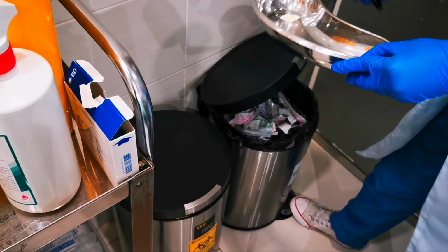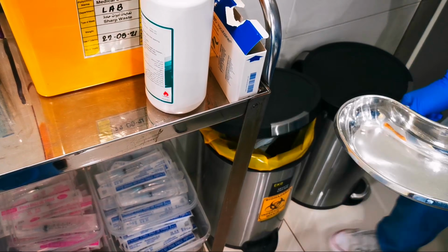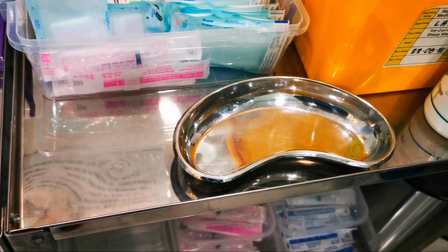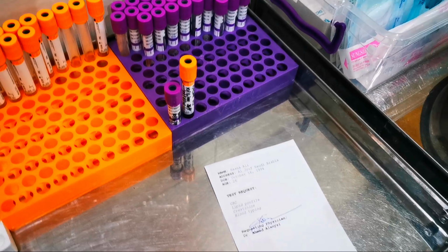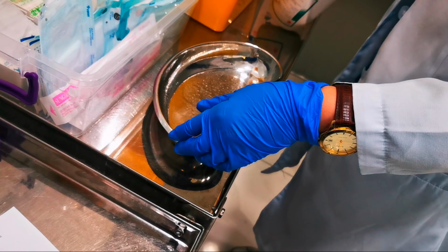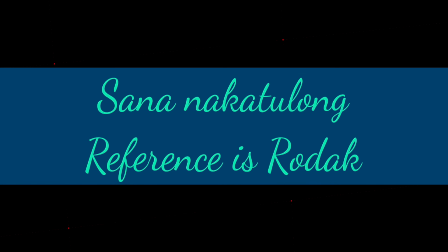Then dispose mo na yung mga nagamit mong kalat. So infectious tsaka non-infectious. Then if may time ka, i-disinfect mo yung area. Yan. And then tapos na yung ating Venipuncture.